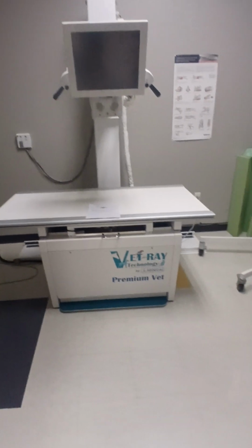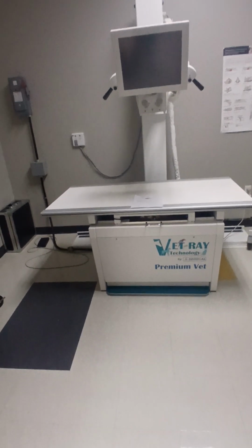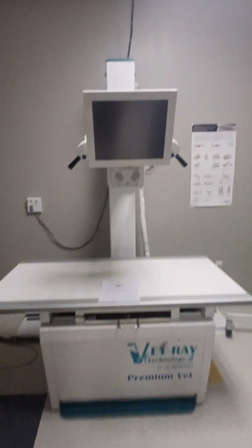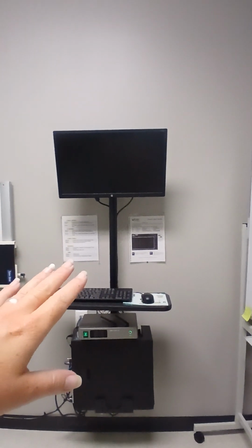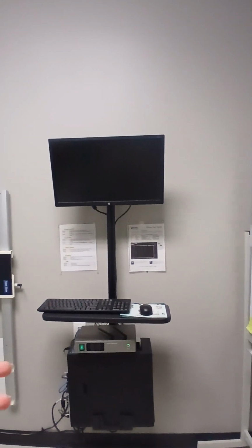Hey friends, we're going to do a quick walkthrough of the radiology room and just show you a couple of the parts that we talk about. So of course we have our table, we've got our control panel up here, we also have the control panel over here. This computer is where you're going to enter patient information and select what views you're going to take, what positions you're going to take.